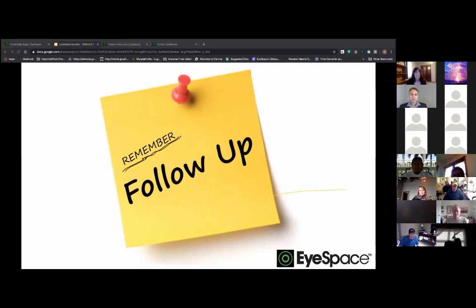In New Zealand, at least, we go pretty hard. We want to go for the maximum. So we'll use a Progen every 6 weeks. We'll have an in-office mini lab soak. We'll use peroxide and a daily cleaner. And that's just because we know that patients won't do everything. So if we give them the whole gamut, they'll probably end up doing something more hygienic than we would expect otherwise.